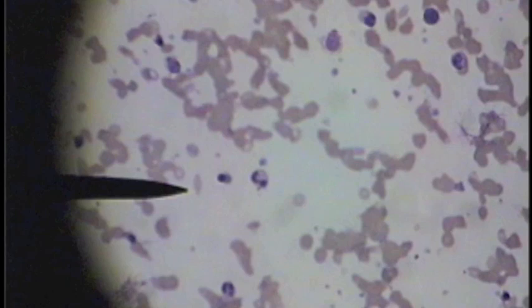This is sickle cell anemia. At the tip of the pointer and scattered throughout the smear you see atypical red blood cells. You can also see too many white blood cells, but on this particular slide we're focusing on the shape of the red blood cell — sickle cell anemia.